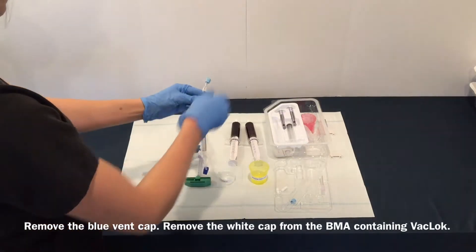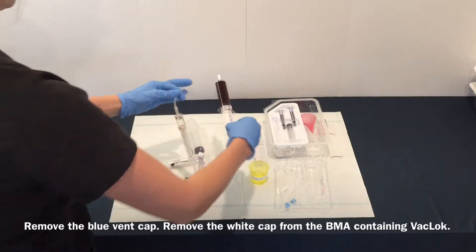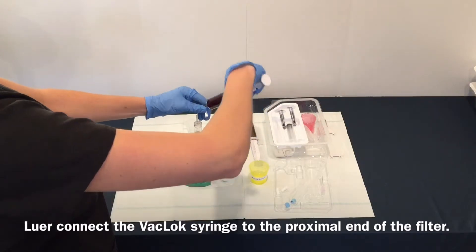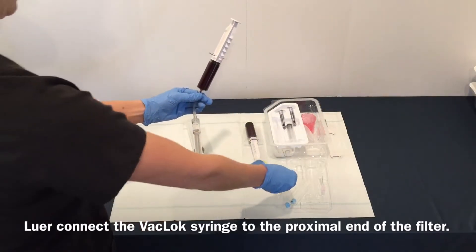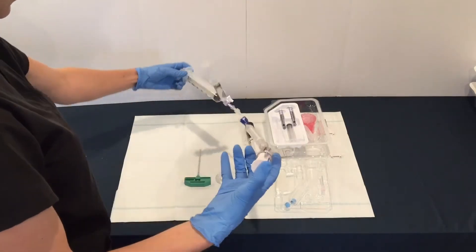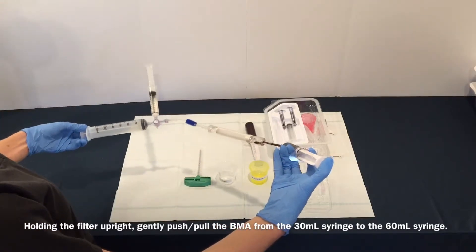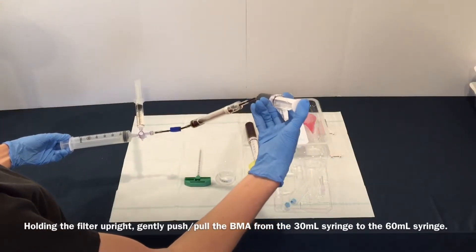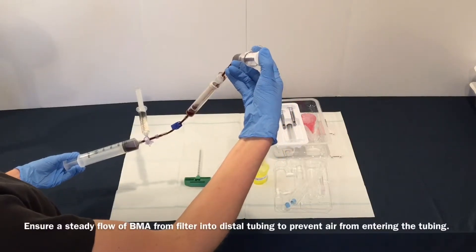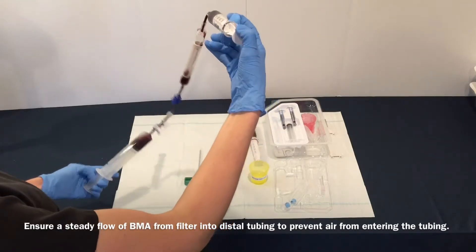Remove the blue vent cap and remove the white cap from the BMA-containing vaclock. Luer connect the vaclock syringe to the proximal end of the filter. Holding the filter upright, gently push-pull the BMA from the 30 mL syringe to the 60 mL syringe. Ensure a steady flow of BMA from the filter into the distal tubing to prevent air from entering the tubing.